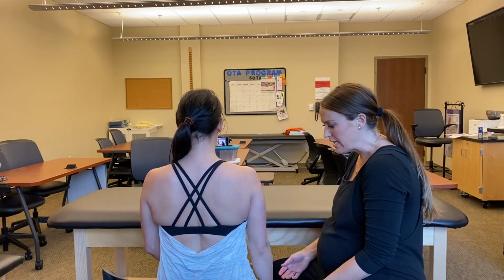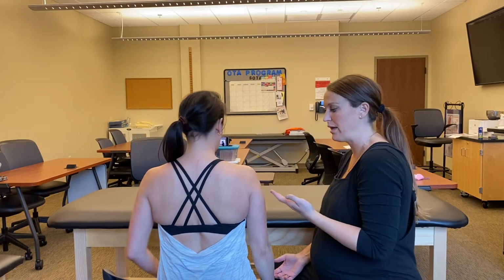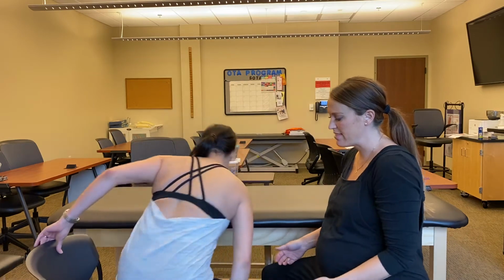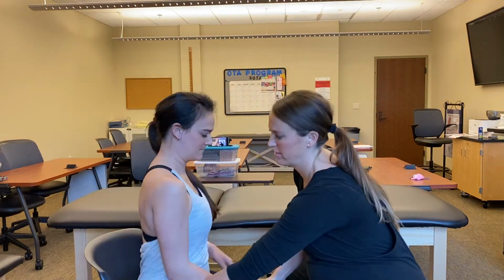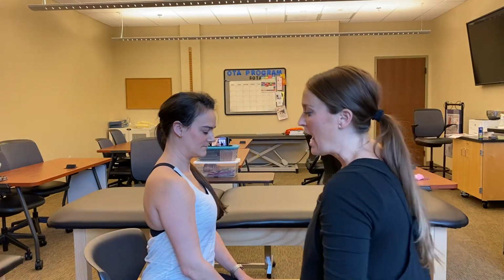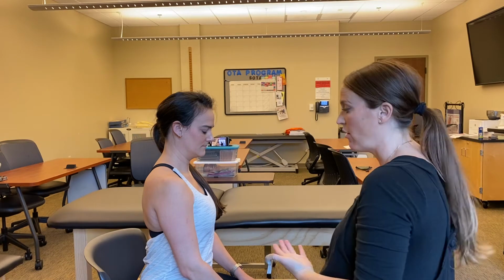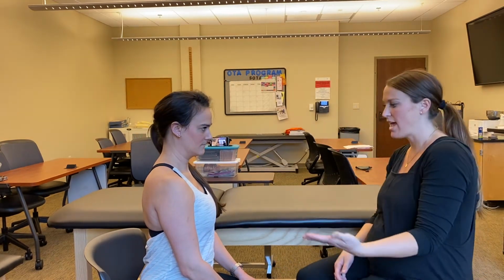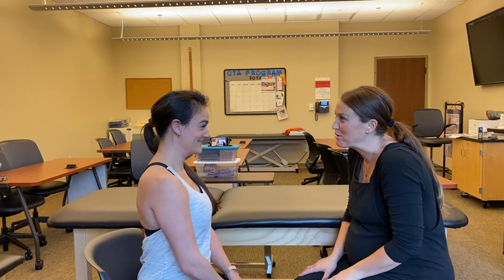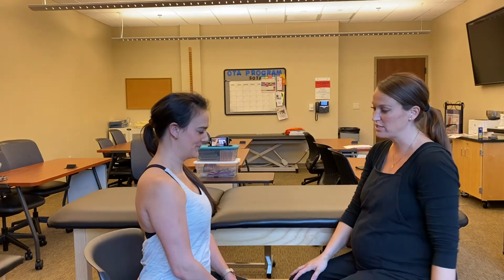So when you're measuring this, first of all, you're gonna talk to your client, you're gonna tell them what you're doing and why. And then what I like to do is see what they have actively. So I will show the patient the movement. So I'll say, I'm Jennifer, I'm your occupational therapist. Today we're gonna look at the movements of your shoulder and measure those today.